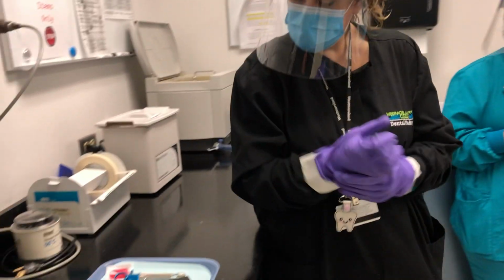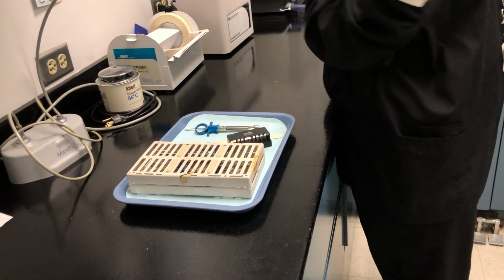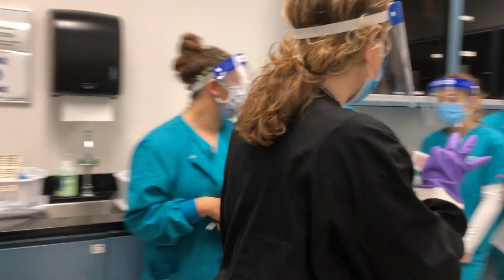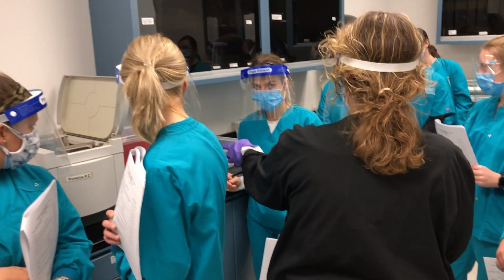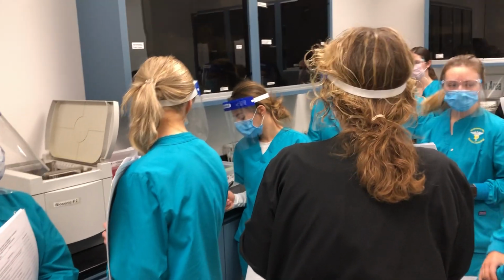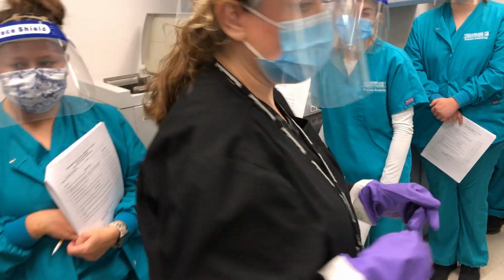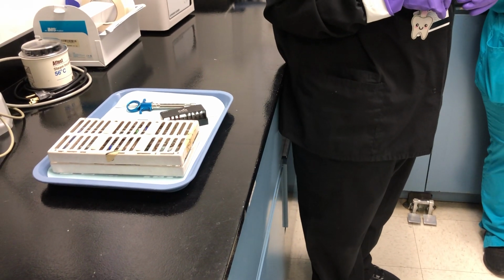Then next on there, it says dispose of biohazardous waste in appropriate receptacle. So we haven't done this, but what's your guess? Blood. Anything that's soaked in blood or saliva, I think we actually did talk about that when we did the demo through here. When you come over here, the biohazard is typically covered with this cassette to be sterile, but I uncovered it. But what are you looking for in the little garbage receptacle that indicates biohazard? The biohazard sticker. Good, the biohazard sticker that's down in the little round hole. So we're going to set this right in front of here, indicating we know that goes normally into that garbage receptacle, okay?